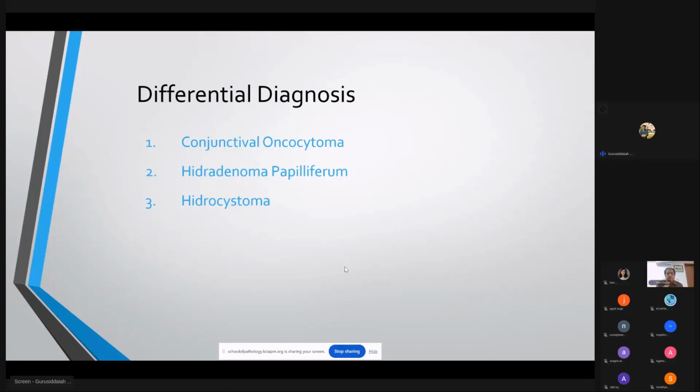There's a microcystic pattern along with a few goblet cells seen. And there is a cystadenomatous papillary projection projecting into the lumen. And the negative findings are that no mitotic figures were seen, no infiltrative margins, and no nuclear pleomorphism.